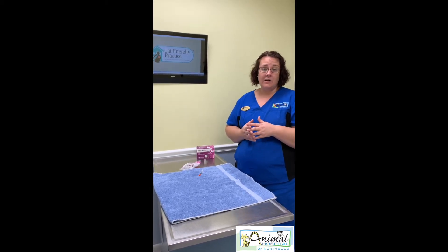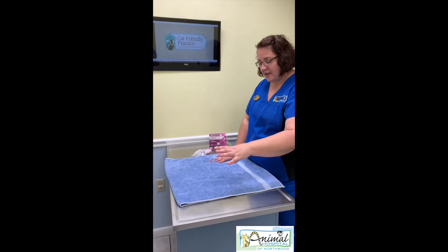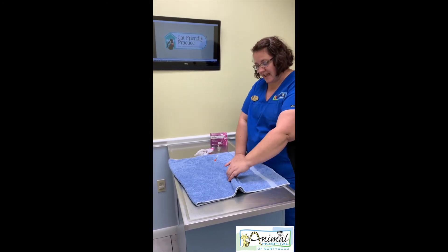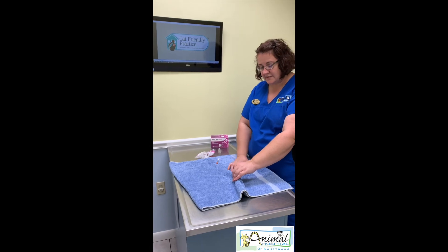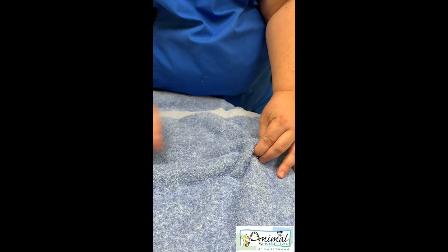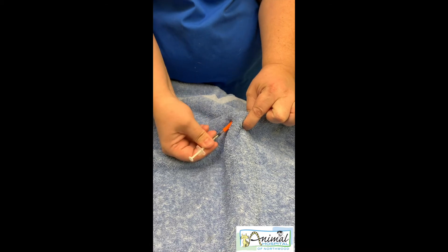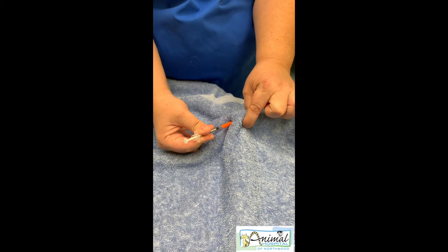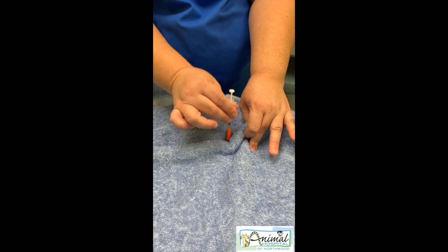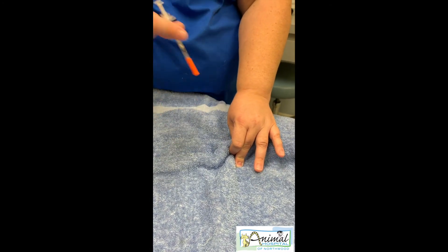That area is right behind the shoulder blades — so behind the head. We'll pretend this is a cat: here's the head and the shoulders. We're going to pinch that loose skin between the shoulder blades and make a little tent. Then we inject the insulin at a 45-degree angle. That way you don't go straight through and poke yourself or squirt the insulin out, and you're not going straight down, which could cause pain especially if your pet is skinny. Insulin injections should be very painless and not a big deal.